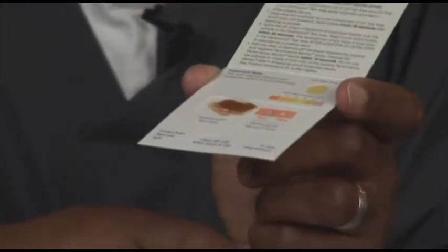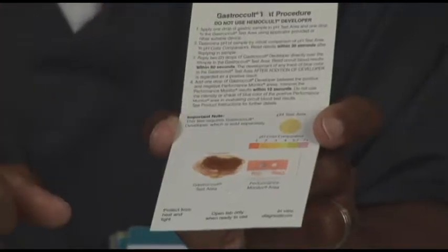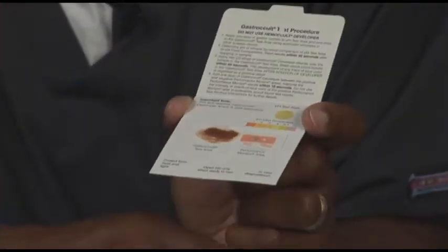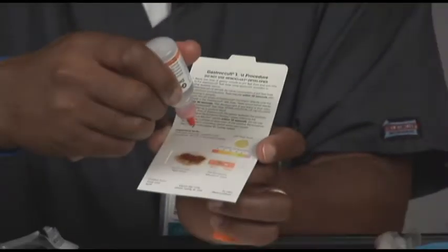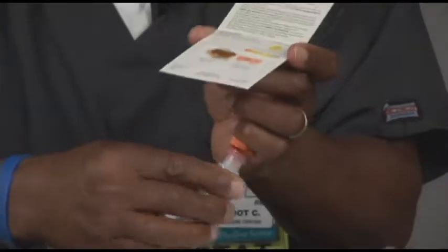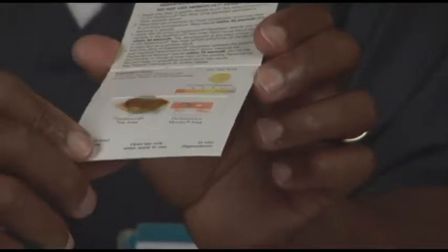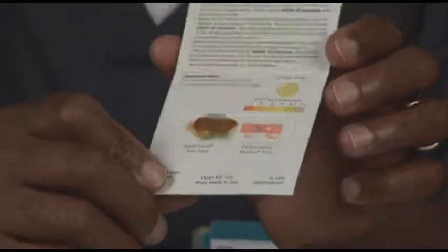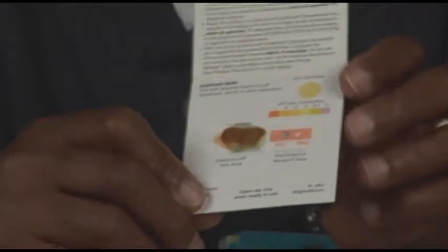And again, your positive control should turn blue. Your negative control should stay white. And after you've done that and your card checks out, place a drop on your specimen. If there's a blue halo around it or the paper turns blue around it in any fashion, that is recorded as positive. If no color change, if it remains white, that is negative.